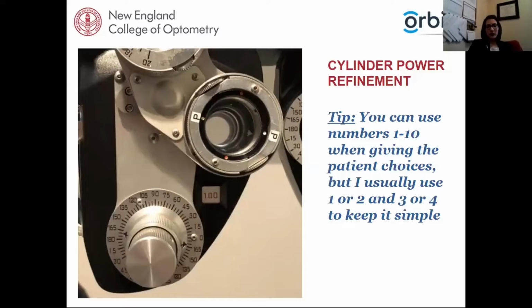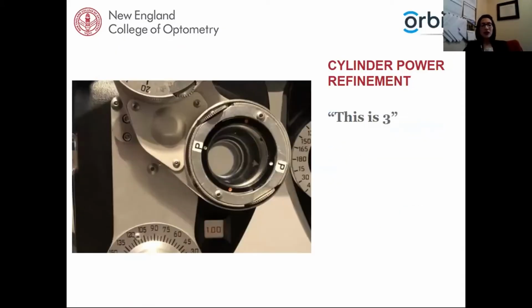You may also have noticed at this point that I've been saying 1 or 2, 3 or 4, and then going back to 1 or 2. Technically, you can give whatever number options you want to the patient. I don't know how many providers really go above 10 if they're giving options, but I usually stick with 1 or 2, 3 or 4 just to keep it simple, and then just go back and forth between those. But you could say 1 or 2, 3 or 4, 5 or 6, 7 or 8, up to 10. But I think for simplicity, I personally stick with 1 or 2, 3 or 4, and then go back to 1 or 2 again. So now we're doing our power refinement.